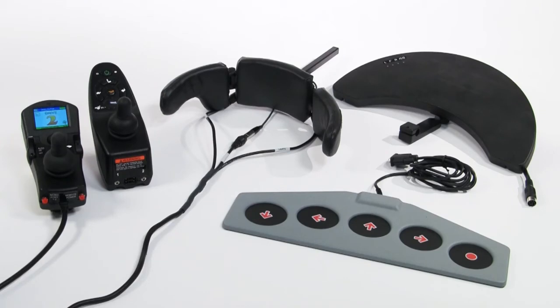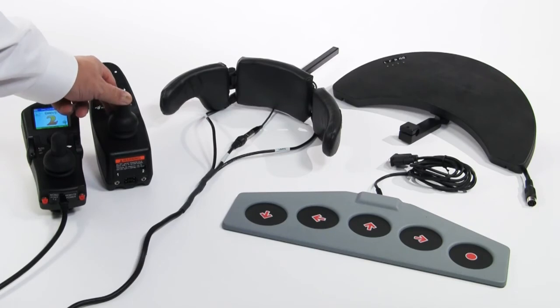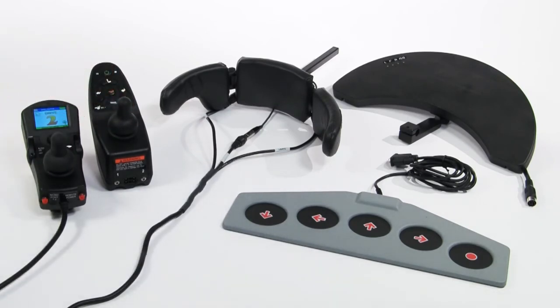Lastly, non-expandable control systems, such as those using an SPJ joystick, cannot accept digital or switch driver controls. Only expandable electronic programs can accept switch controls. Proportional or non-proportional, analog or digital, choices to allow users independent mobility.